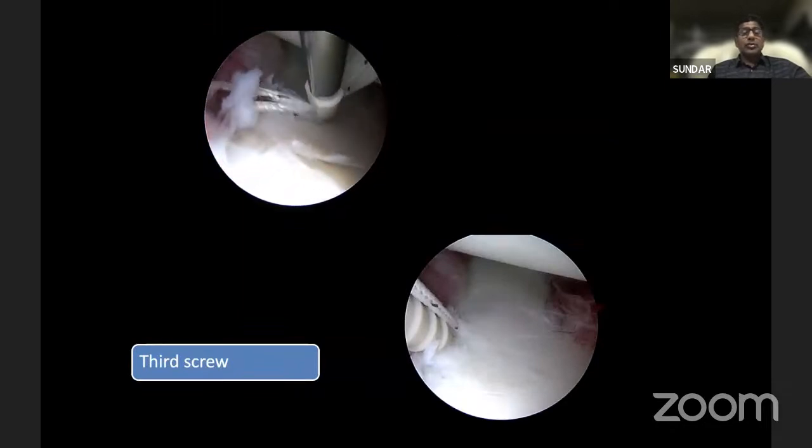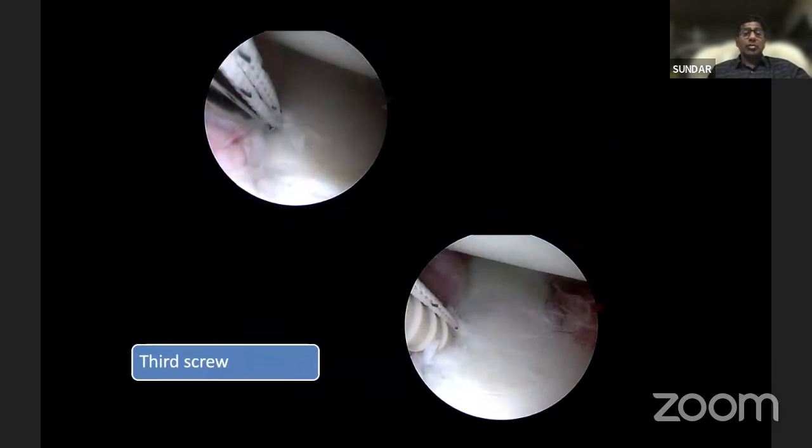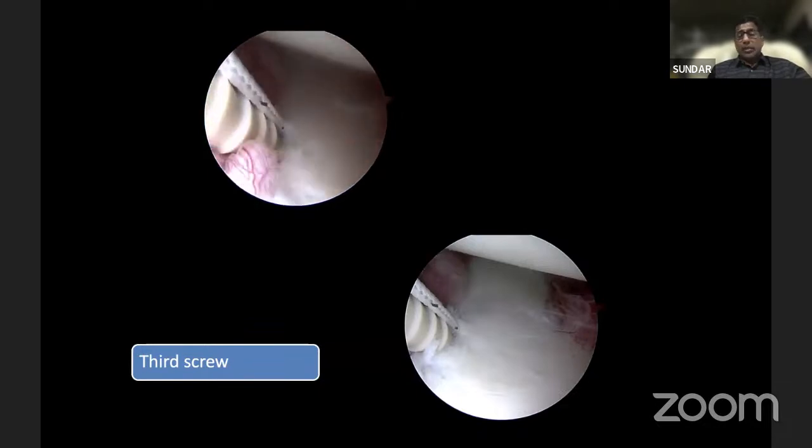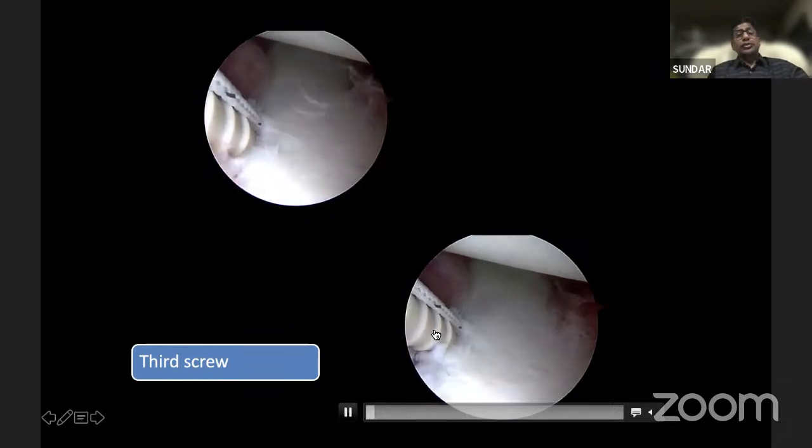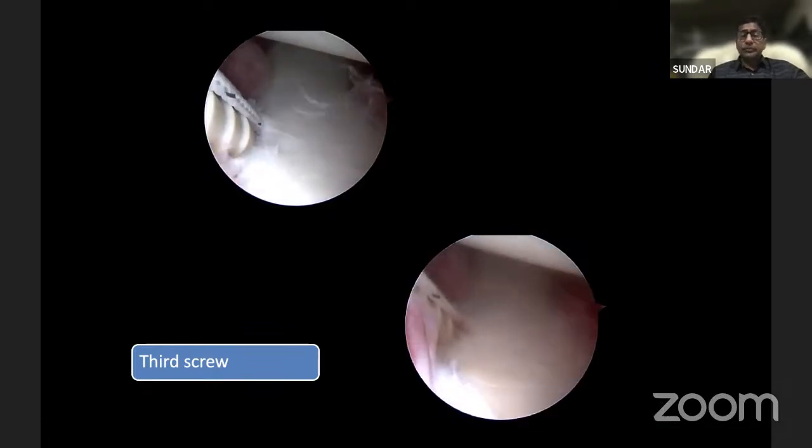Usually you require a minimum of at least 3 anchors, because you have to come up to the front of the subscapularis. So you can start at 5:30, then 4 o'clock, then at least 3 o'clock or 3:30, the third anchor, which has to be inserted.